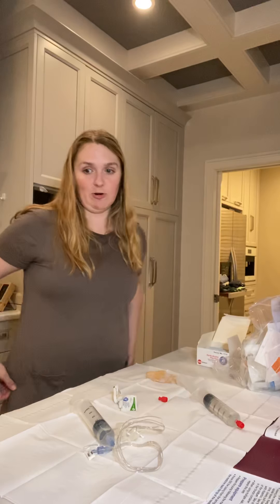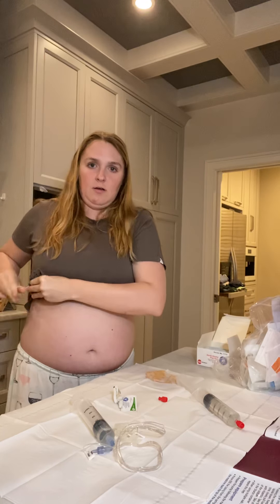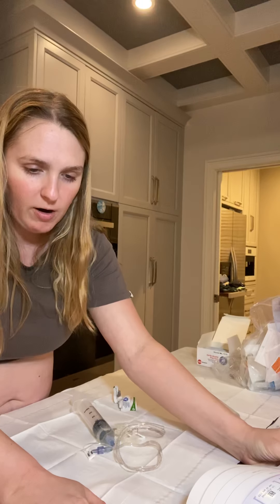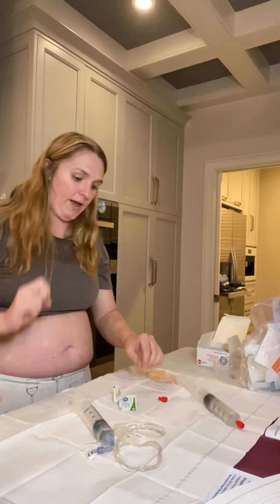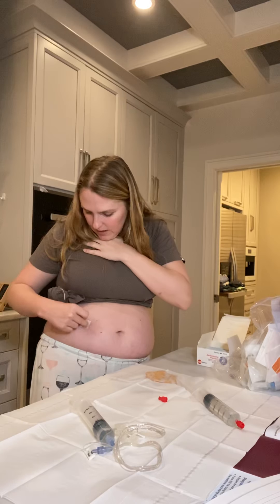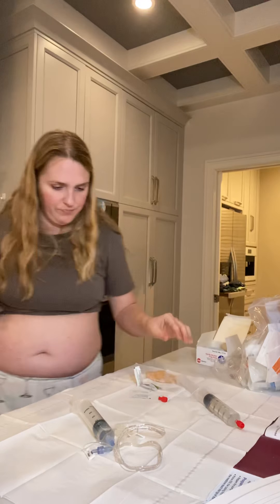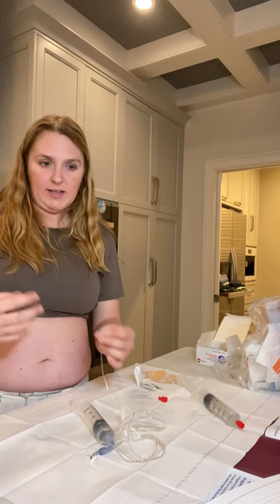Now we get to start the actual fun part — sticking yourself with needles in the stomach. I lift my shirt up because it's just the easiest way to see and do it. I look at where I infused last time so I don't get too close — last time I was really far out high on my stomach and really close in low. You don't want the needles to get too close together. I'll sterile wipe the spots I'm choosing. I'm also visually checking for any sign of having infused recently — a lot of times you can actually see a little mark where the needle was last time.